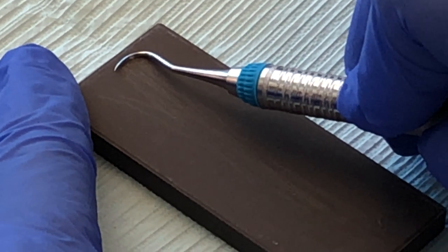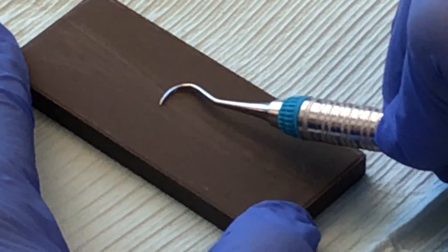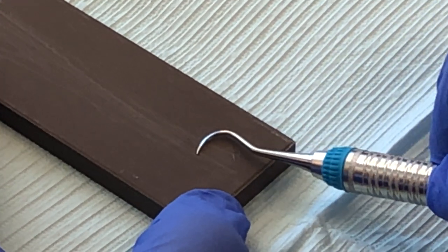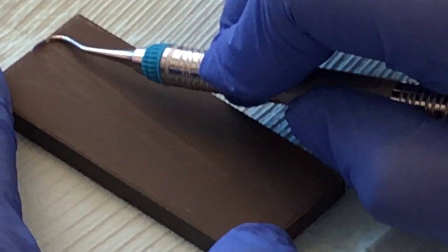Pressure is on the back of the blade as we start off. You can see the trail. As we head towards the middle of the stone, the pressure is shifted there. And as you finish, you come down to end on the toe without falling off the end of the stone.